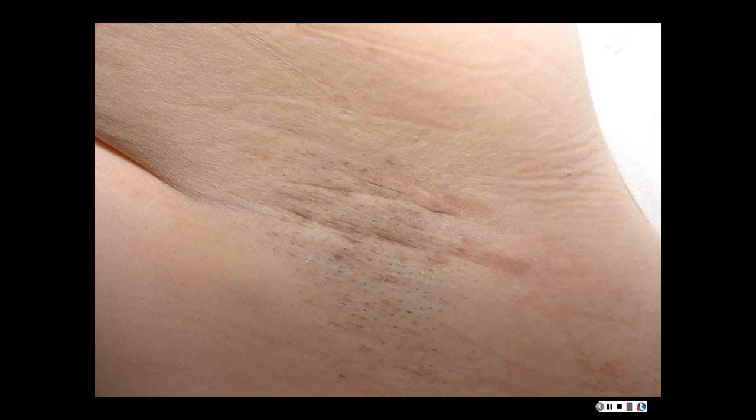Gamma delta or gamma deltas? So gamma deltas are different. Gamma deltas are usually subcutaneous, dermal, and epidermotropic, all three, and gamma deltas are also aggressive lymphomas. You usually see lots of karyorectic debris that is degenerating cells, not neutrophils, not leukocytoclasis, but karyorrhexis from the tumor cells. So they're dirty appearing lymphomas and also aggressive.